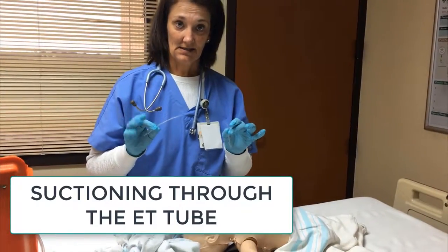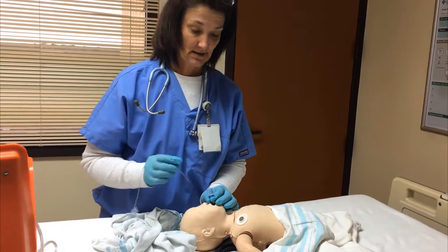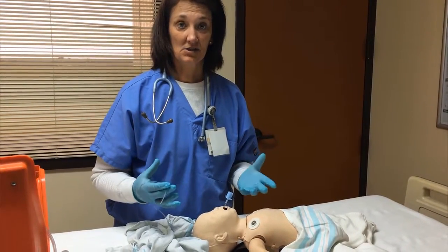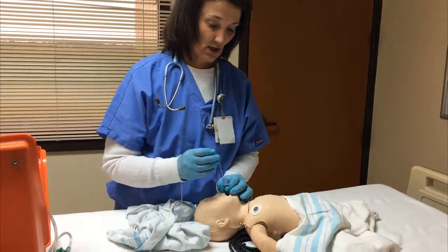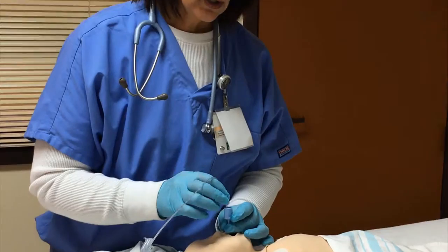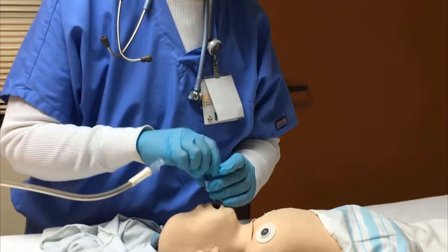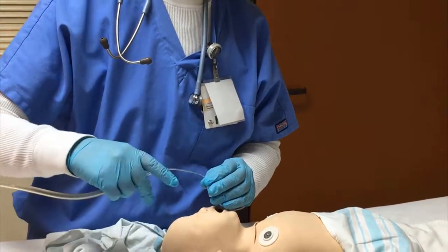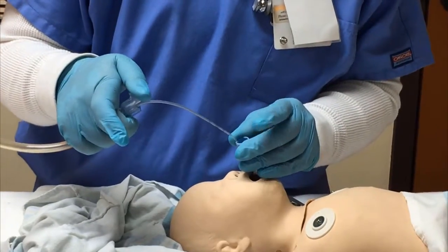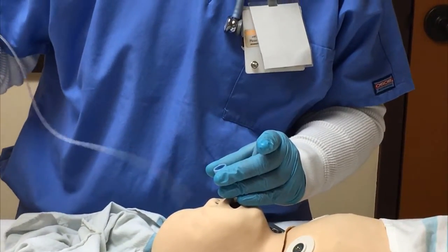The next tube I'd like to discuss is the suction tube that we can actually use to suction the trachea directly through the ET tube. If we feel like we have some occlusions with thick secretions or meconium within the trachea, we can actually insert the corresponding suction tube into the ET tube until we meet mild resistance, and then occlude the suction tube for the 3 to 5 seconds while withdrawing to withdraw any fluids that have been lodged within the trachea.